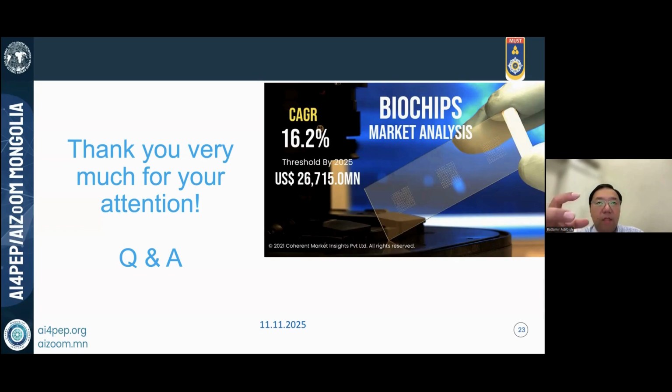The main goal and purpose is detecting whether the sample is positive or negative at the first stage. We have successfully detected it, and the second stage goal is detecting variants. Variants are also detected in just 30 minutes.